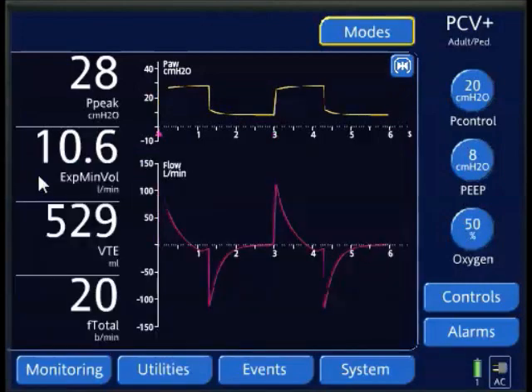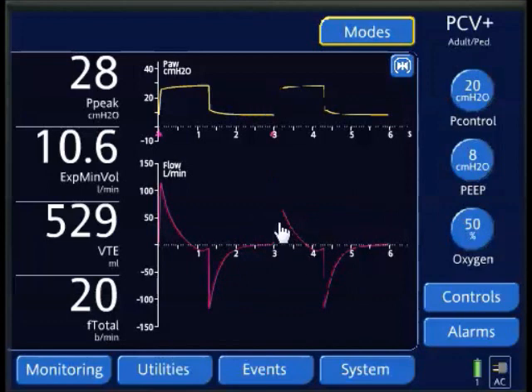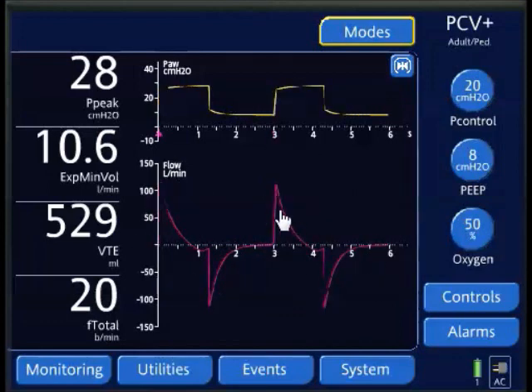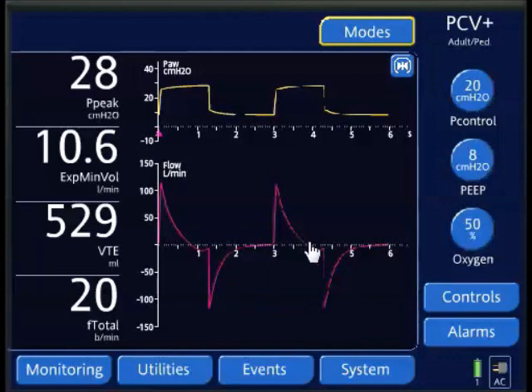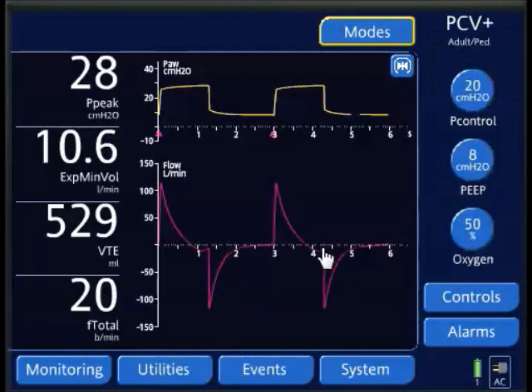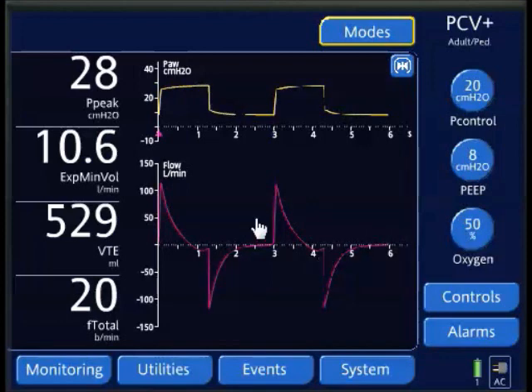However, my plateau pressure and pressure control, when flow fully decelerates—I'm looking at my flow waveform here, and my inspiratory flow is fully decelerating—it becomes a no-flow state. So my plateau pressure should be pretty much equal to my peak.